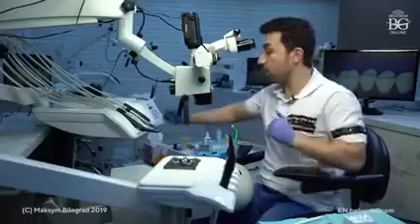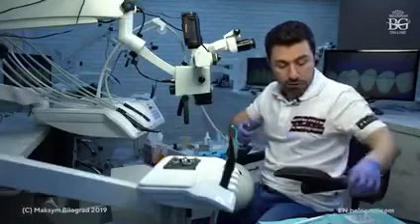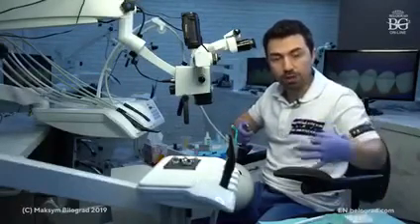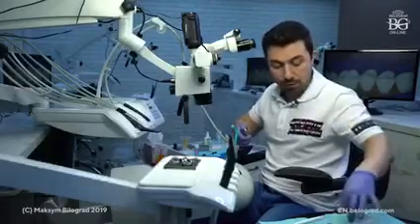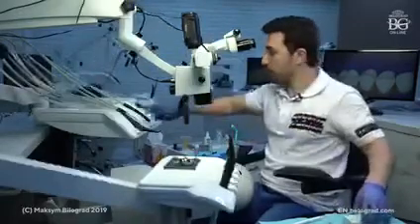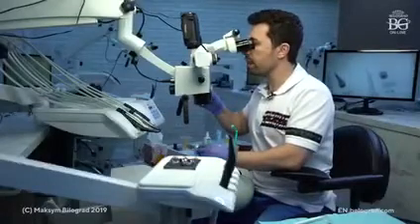Okay, now we're going to have stage 2, and I'm changing the burr for the red one. Previously, I remind you, we were using medium grit burrs and coarse burrs. Now I will use my red diamond burr. The most frequently used one, that I work with a lot in my veneer cases, is this one.